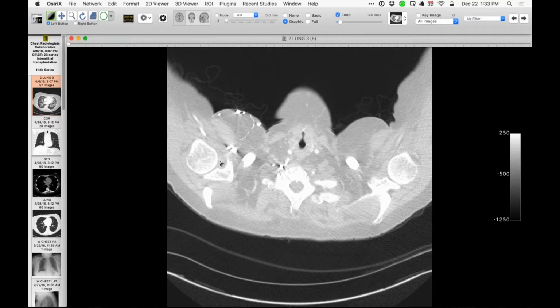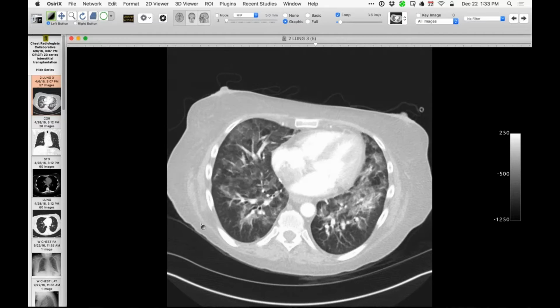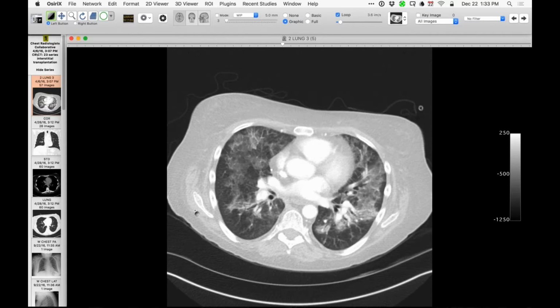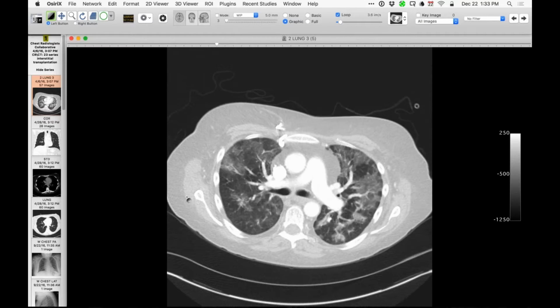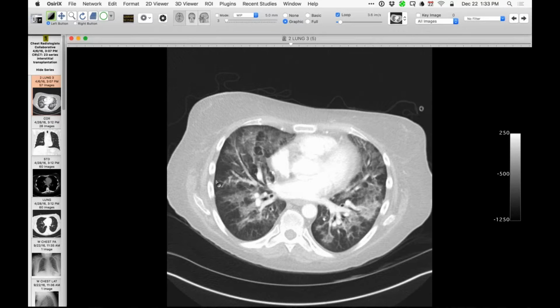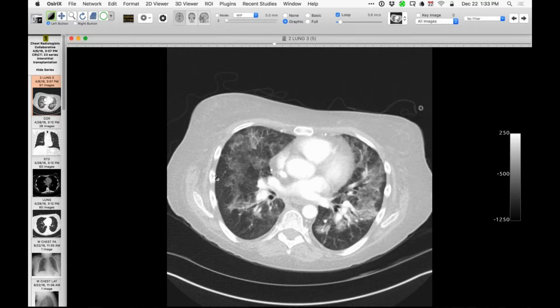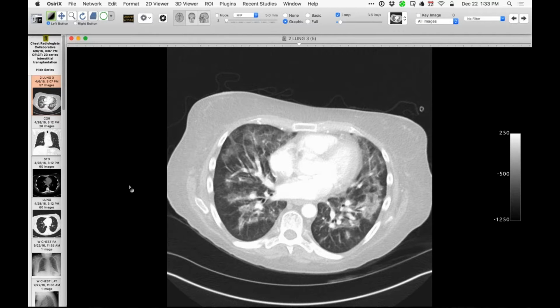She came here, and this is from April, looking like this. And you can see we have the situation we see quite commonly where we have diffuse, patchy, multilobar, confluent ground glass, and maybe consolidative opacities. And we've got the usual differential diagnosis for that, which includes infection and non-infectious disorders. And then we try to limit the diagnosis depending on how much time has elapsed from, in this case, the allogeneic transplantation. And there's a differential diagnosis for that. But what was really interesting was she was treated with steroids.